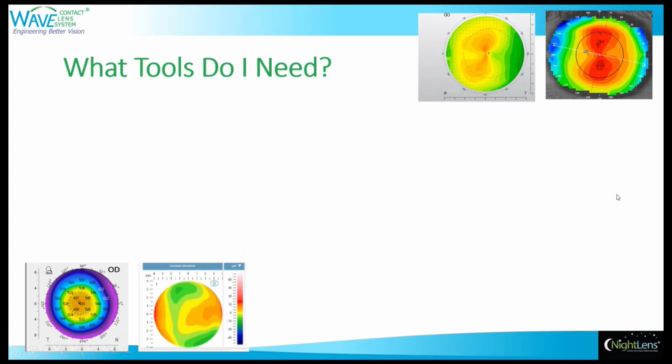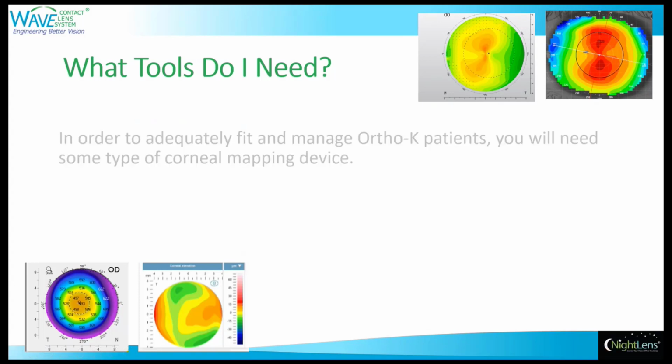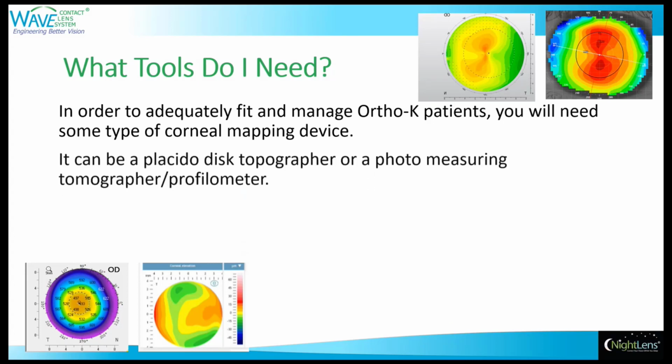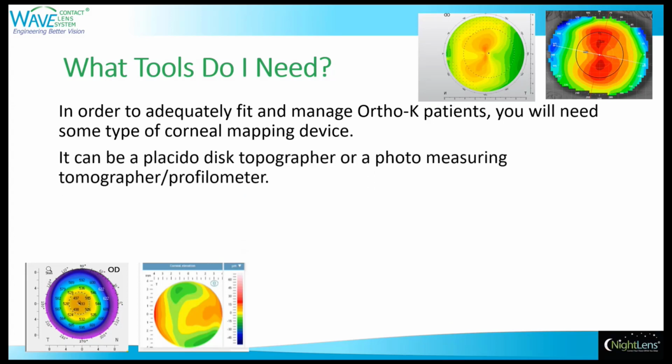The other question that you might ask is, what tools do I need? Well, in order to adequately fit and manage these patients, you will need some type of corneal mapping device. In the upper right, you will see photographs of two Placido disc topographers, and then on the lower left, you will see photographs of a tomographer or profilometers.